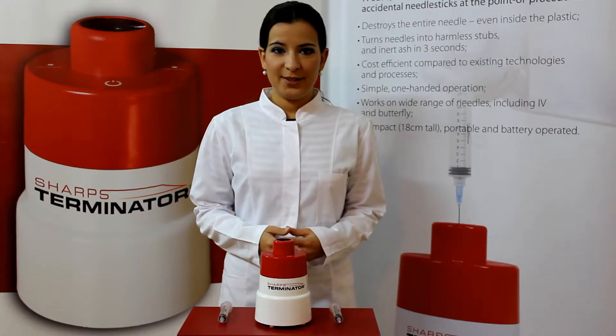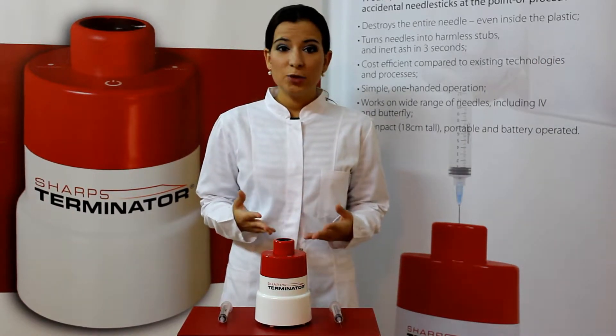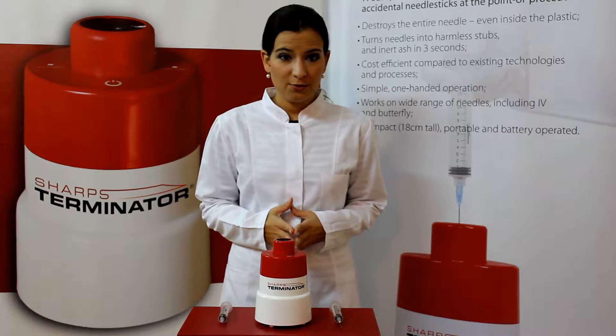The Sharps Terminator is intended for use by both healthcare professionals and individuals who use needles. It is battery operated and mobile so it can be used in different locations.